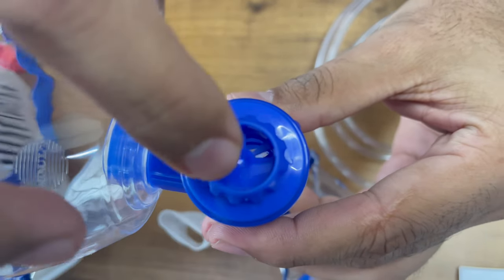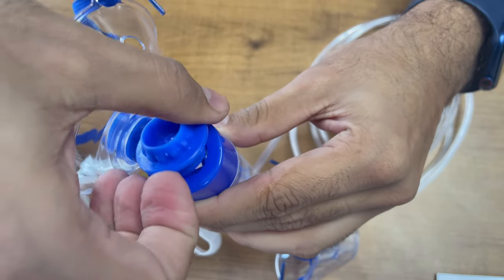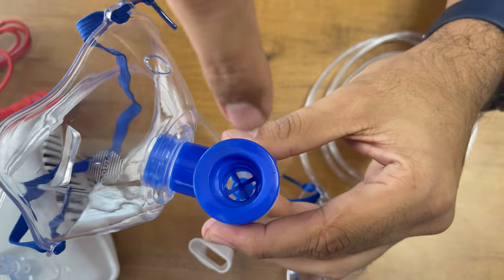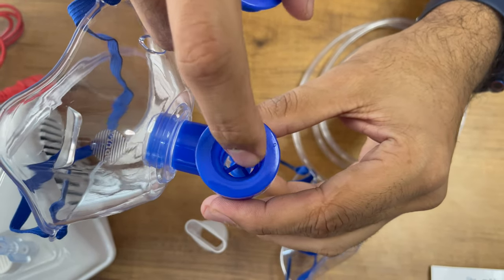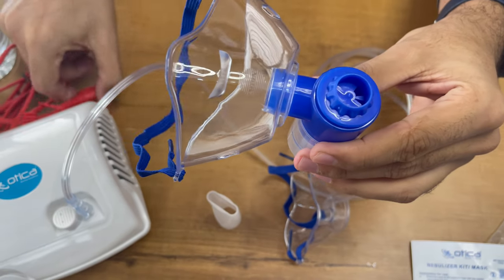This is the flow adjustment valve — you can control the flow speed from this. Make sure there is no water inside. You have to insert the medicine by removing this cap, insert the medicine in this hole, and then cover it with the controller.